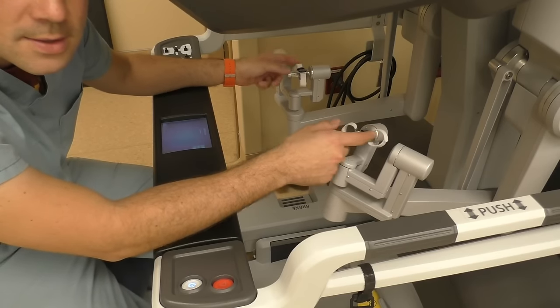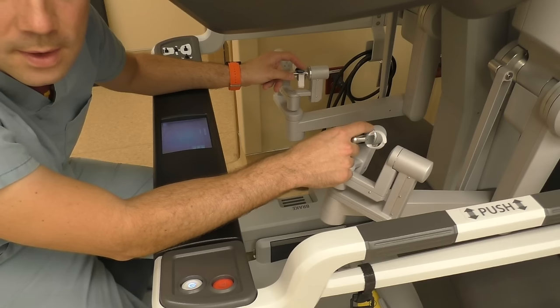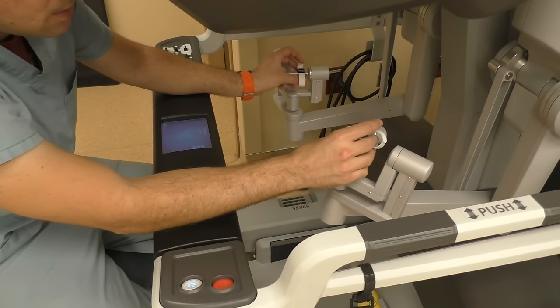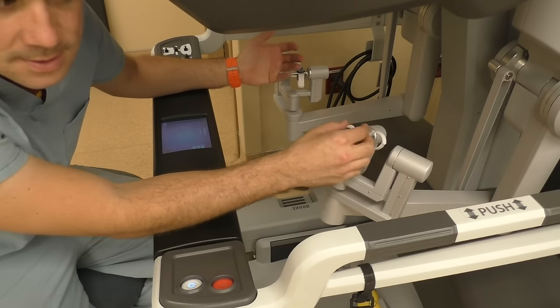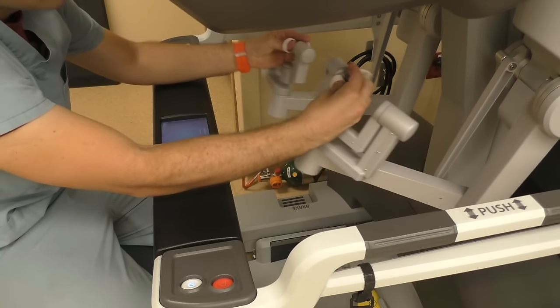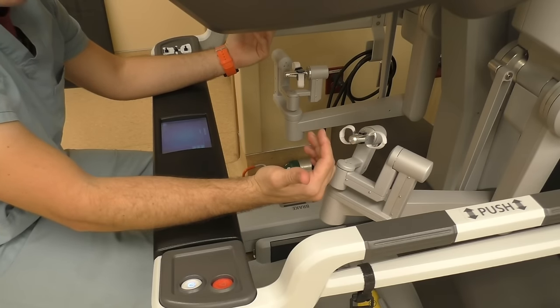Now these two little guys here are basically the most important part of the console. This is what the surgeon is going to be using to operate with — this is translating all movements from the surgeon's hands directly to the robotic arms and the robotic instruments. They have full 360-degree range of motion and clamping, cutting, and staple use.